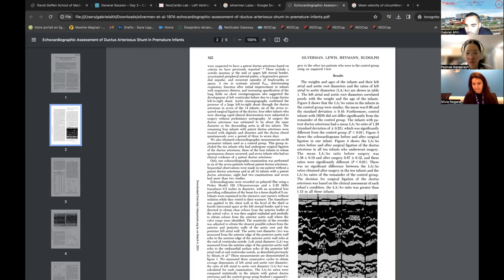Does that make sense? You can see the leaflet of the valve closing here, and the junction of these leaflets is here. And then you can see that junction move in time, and then it reopens. So the aortic valve is closed in ventricular diastole. Right? Aortic valve is closed in ventricular diastole. And typically, when the aortic valve initially closes, it means that the left ventricle has just finished emptying. Does that make sense to you?